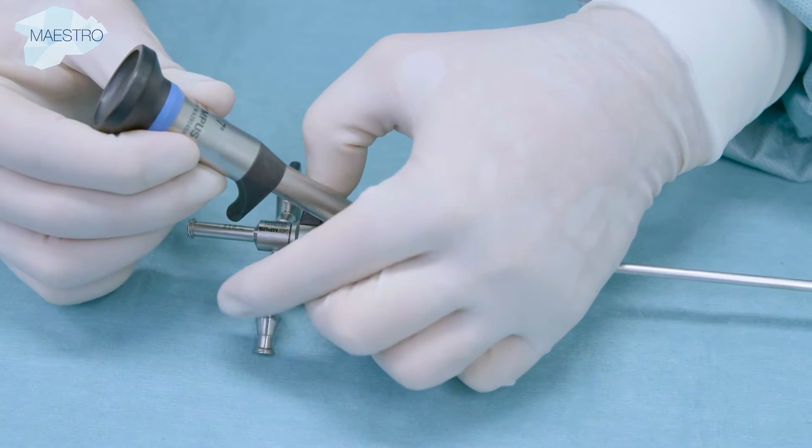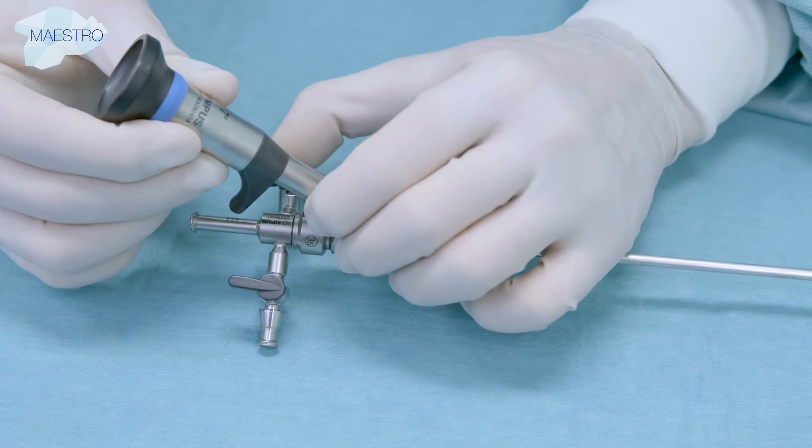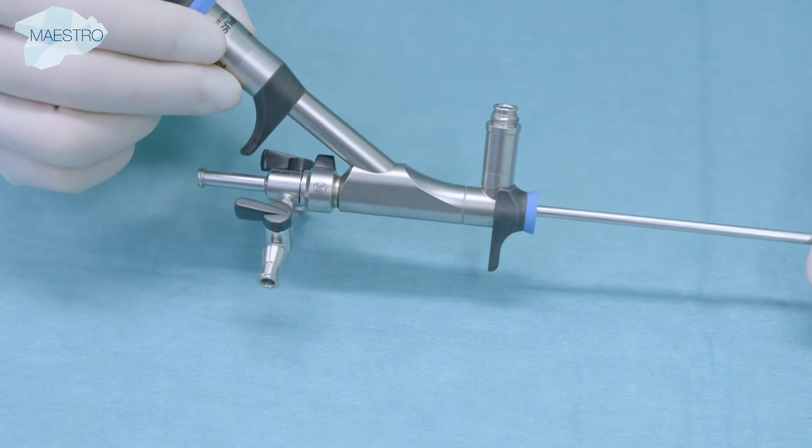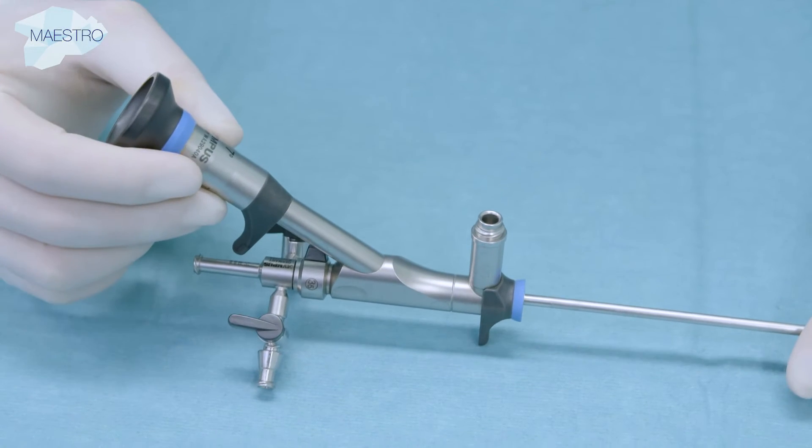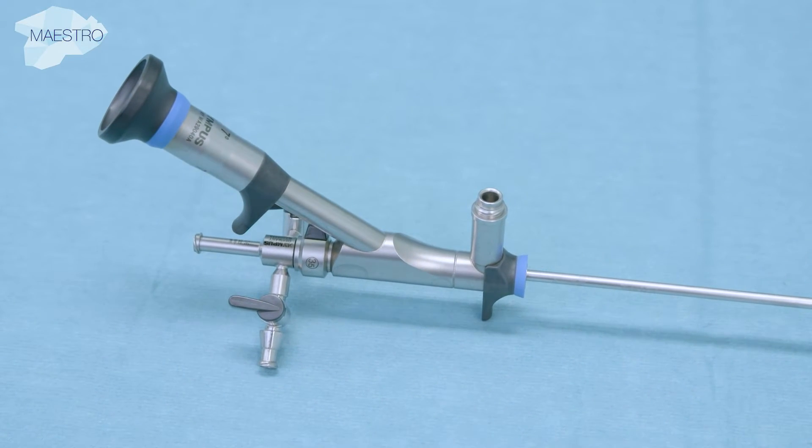Using the stopcocks, the in and out flow can be regulated. The working channel can be sealed with caps or additional port seal adapters. The scope as shown has a 7 degree direction of view.